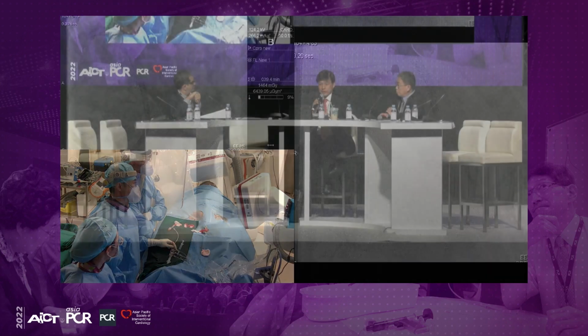Yeah, so I think that's a real wonderful case of systematic lesion preparation guided by intravascular ultrasound imaging. Going through every step of the lesion prep, beginning with rotablation, then followed by NC balloon, cutting balloon, scoring balloon, and then shockwave lithotripsy, looking at the entire anatomy of the lesions, and then guiding you along the way as you decide what's the next procedure. You can see from the final IVUS that the stent strut is almost blended with the calcium. You can't see where the stent strut is and where the calcium is anymore.